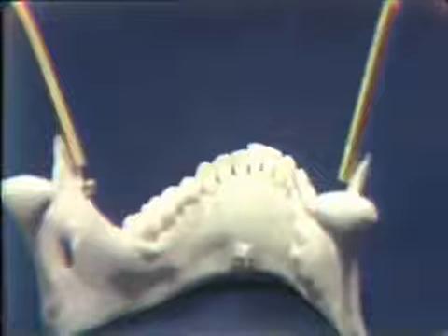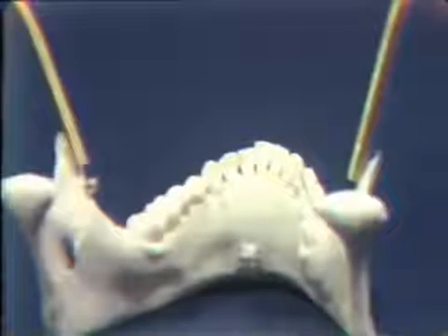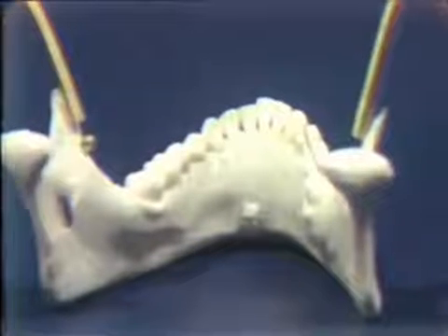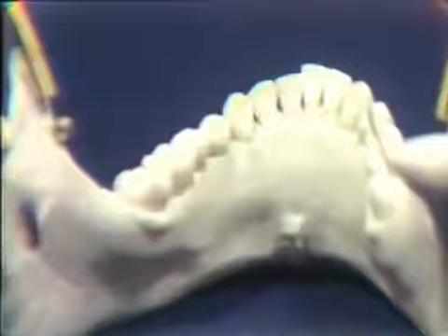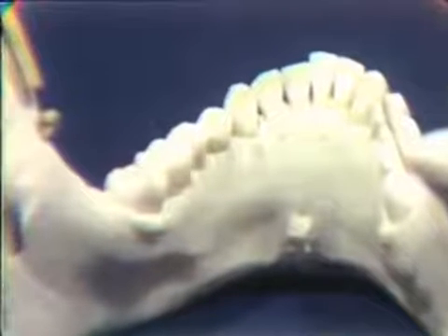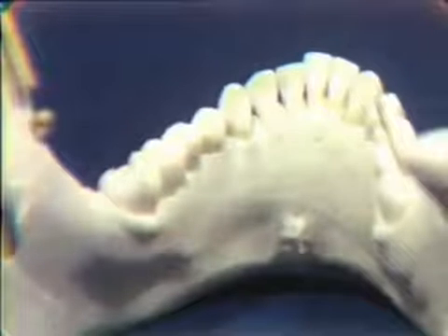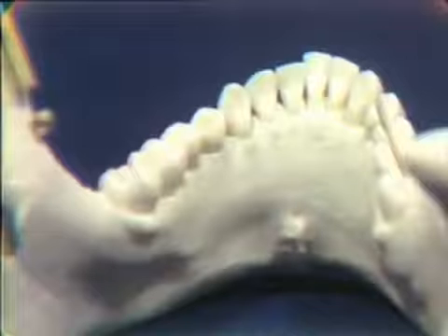I should like to demonstrate lingual alveolar soft tissue infiltration to you. Let us suppose that we were going to remove this lower left cuspid, and we'd already accomplished labial infiltration. We know that in removing this lower cuspid, by forceps application, etc., we would be disturbing or manipulating these lingual alveolar soft tissues.